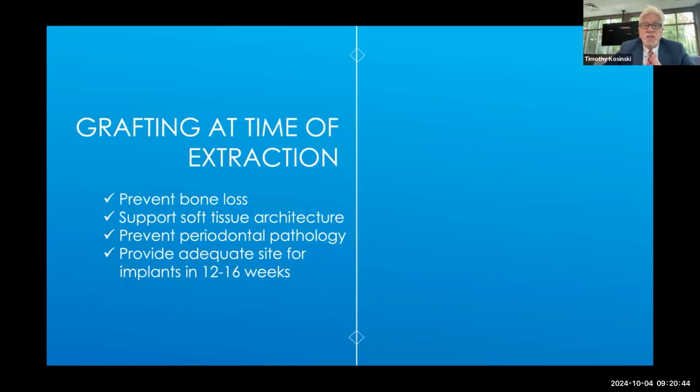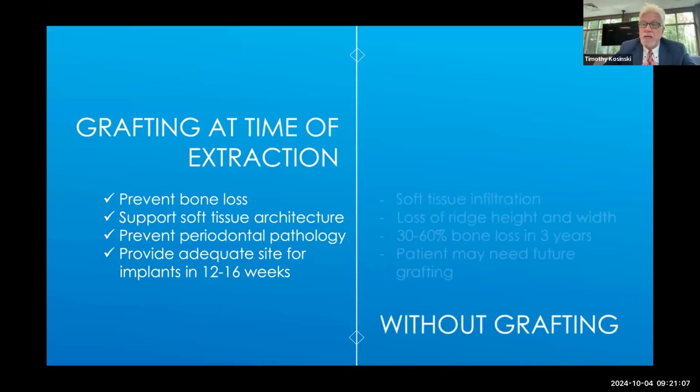Grafting at the time of extraction will help minimize bone loss, supports the soft tissue, helps prevent periodontal pathology. And the literature is clear that we can provide an adequate site for implants in a very short 3 to 4 month period. And we can objectively determine the integration of a graft radiographically with our digital radiographs.